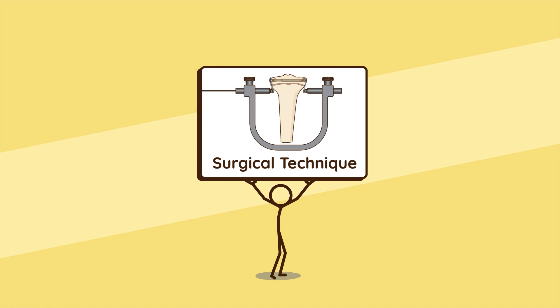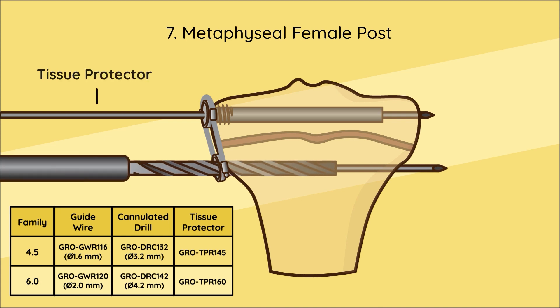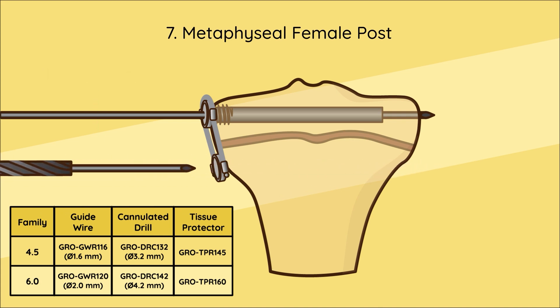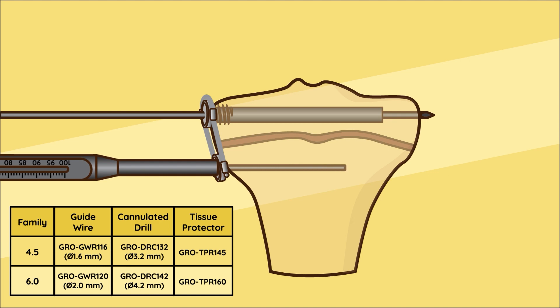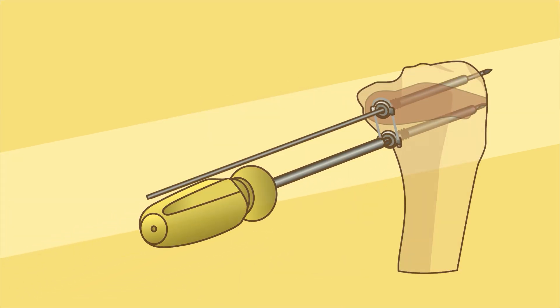Step seven - metaphyseal female post: Prepare the metaphyseal channel. Measure the length of the channel with the depth gauge to select the metaphyseal post assembly length. Insert the metaphyseal female post.